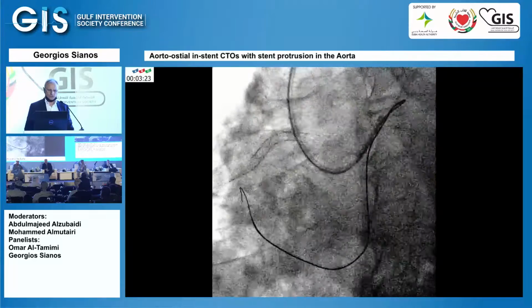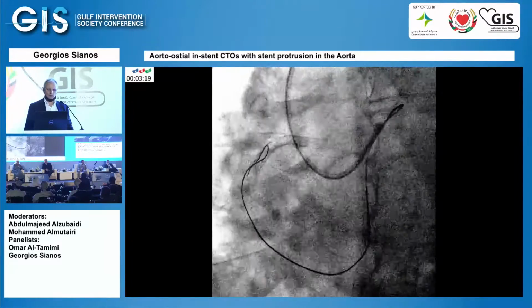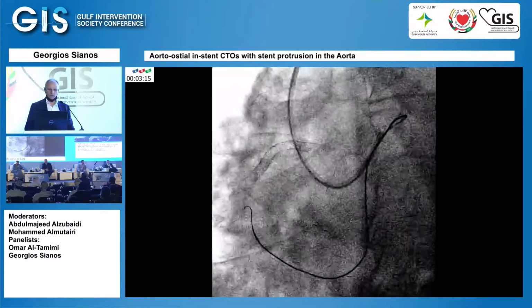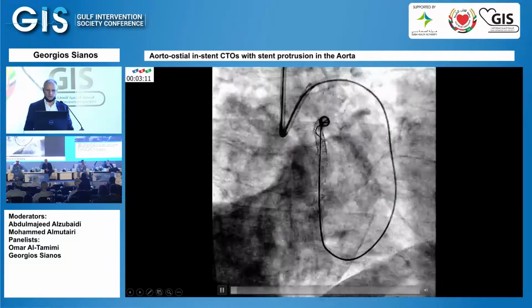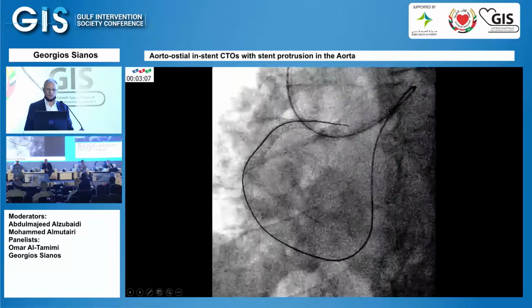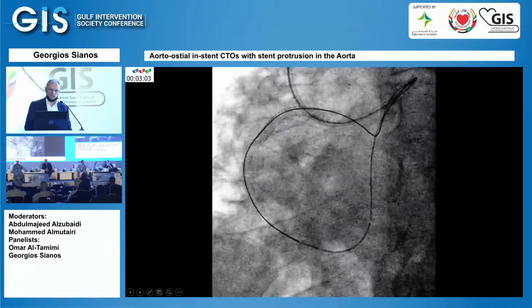In these kinds of cases, I always knuckle wires, and you see a knuckling if you want to go into the stent, but the knuckle in this case didn't work well because you see that it went completely outside of the stent. So actually we took it back, and then we made some tip injection, and again with a Gaia Third this time. The first one was a Gaia First. It went through to true without much.